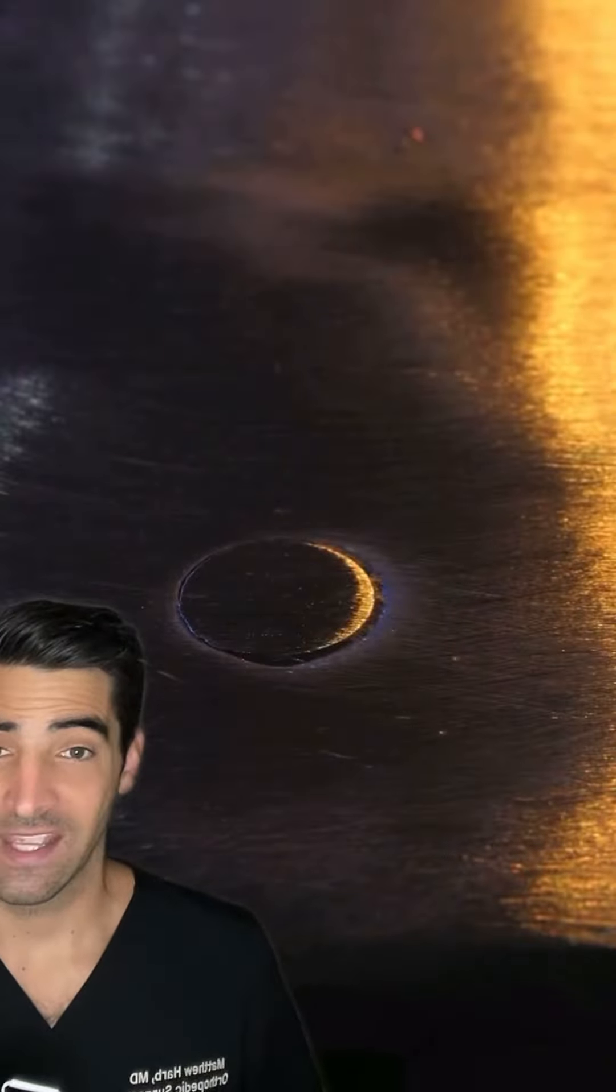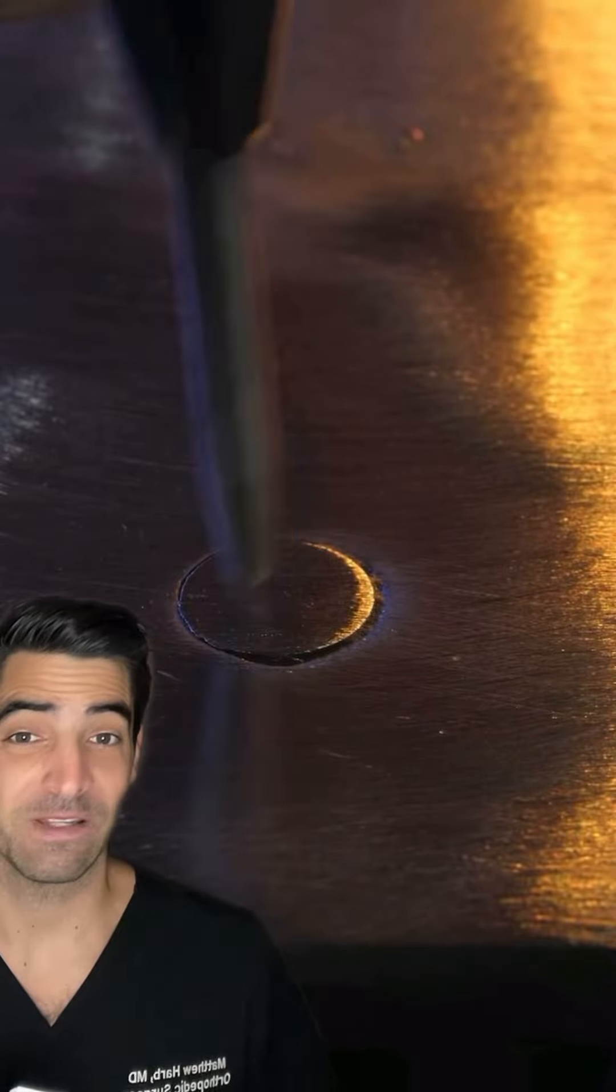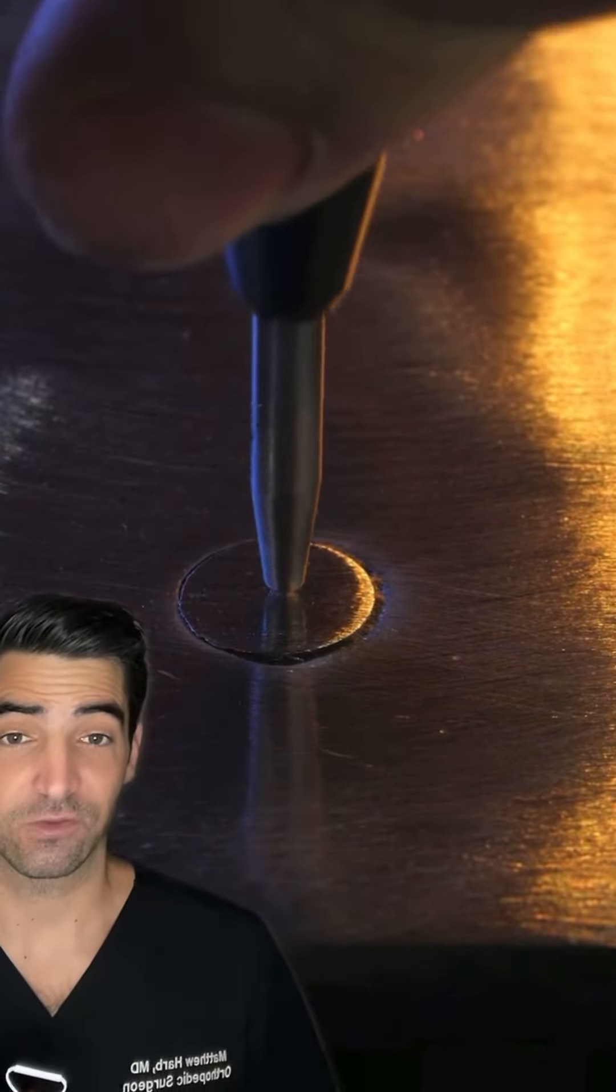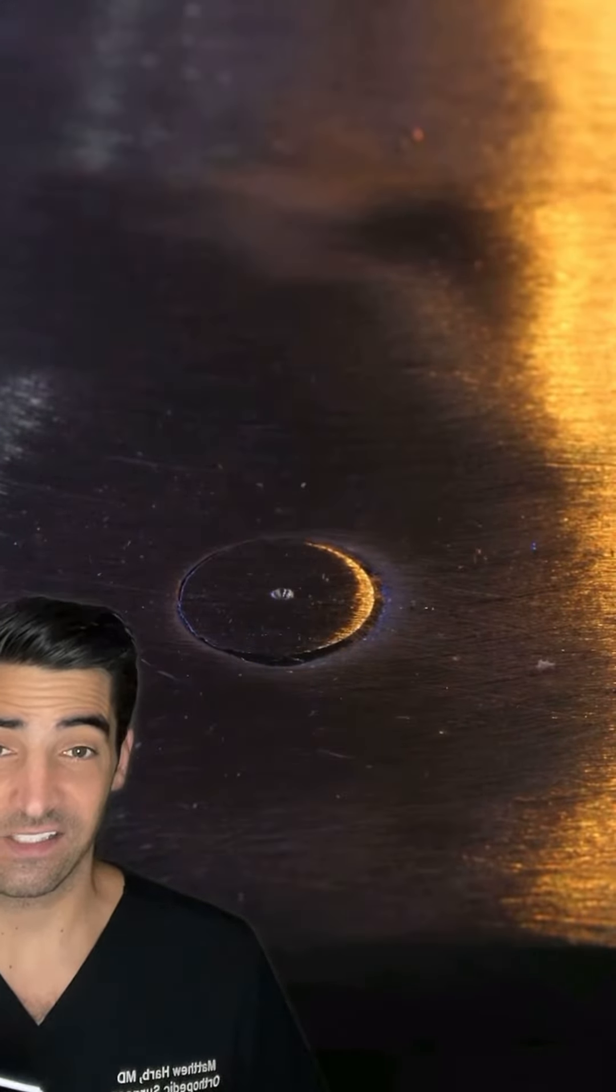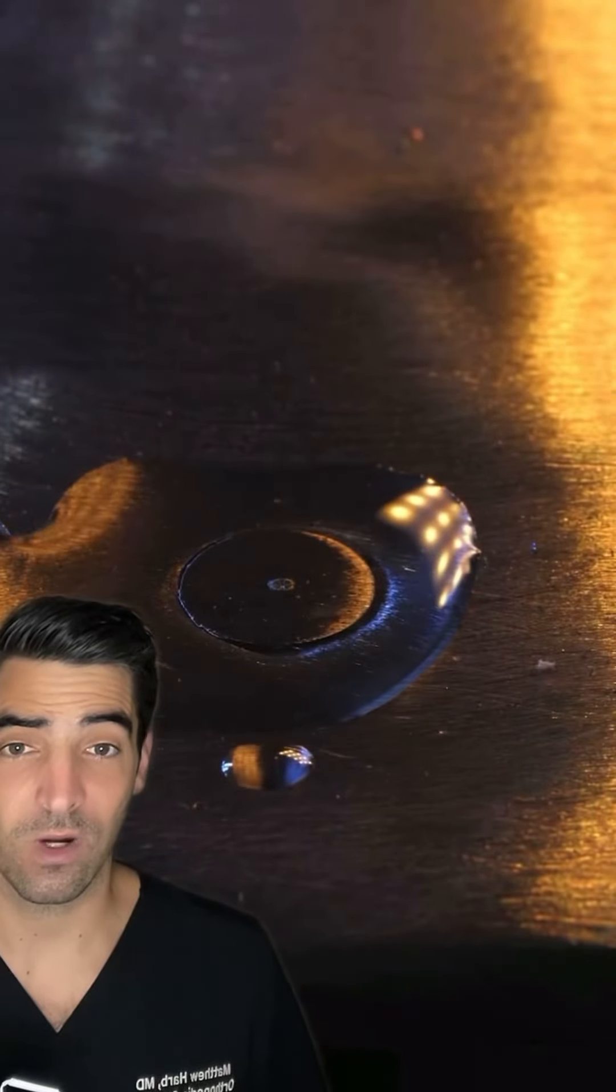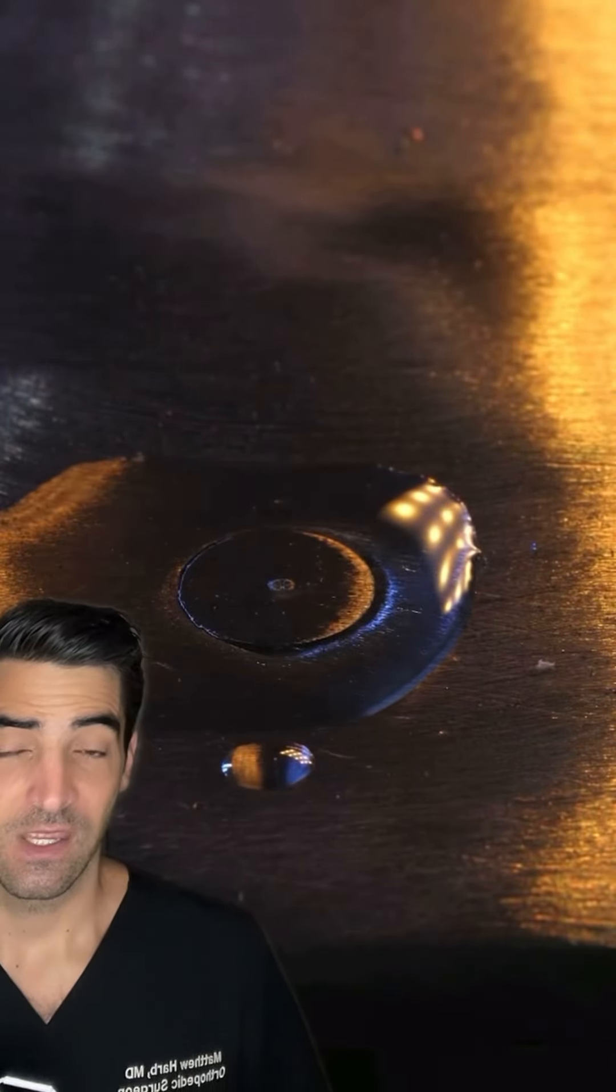There are a couple different techniques for what we call hardware removal, and sometimes it can be very difficult. Like if the screw is completely stripped, then a regular screwdriver won't work on it.